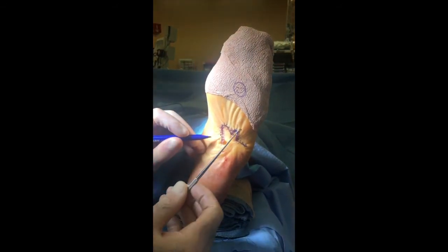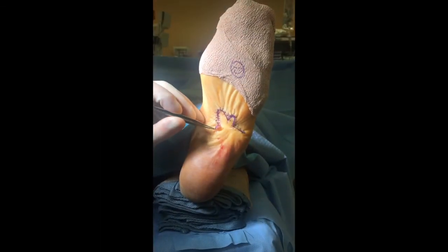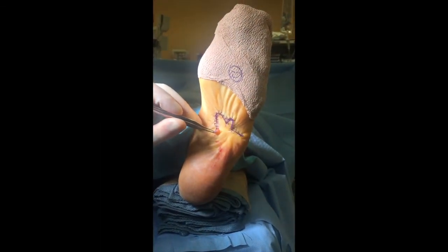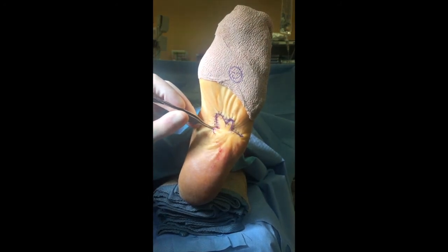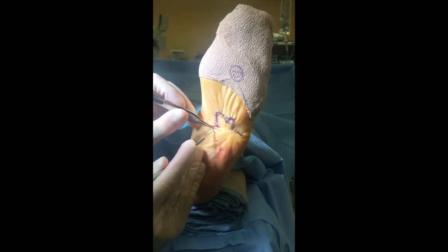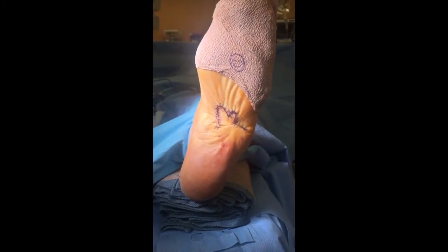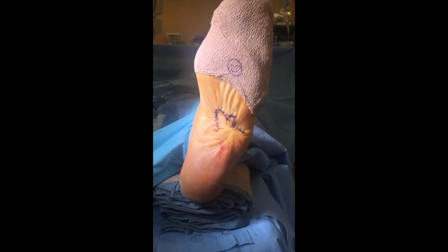Then pull that flap over, cut it again, and it will be the shape of a triangle — that's called the Burrow's triangle. We've made our cut here, and now we can pull this dog ear over, lay it over that line, and cut right along there. You can see that's going to be a triangle. The dog ear has been excised.